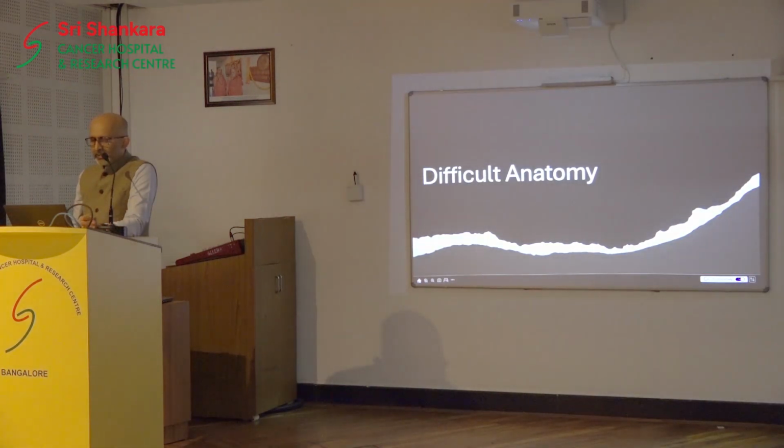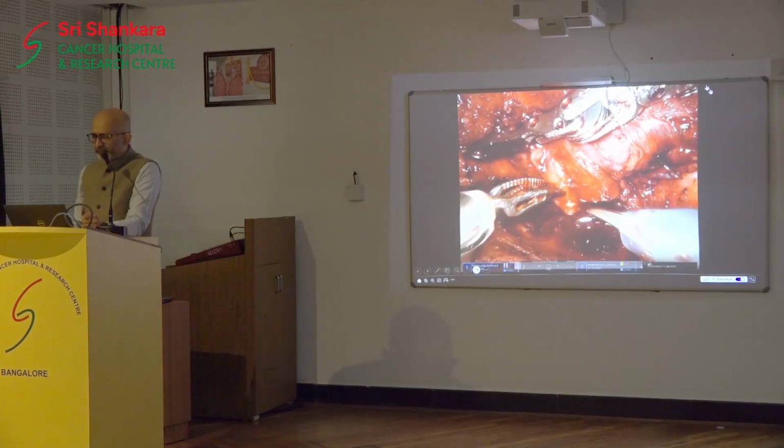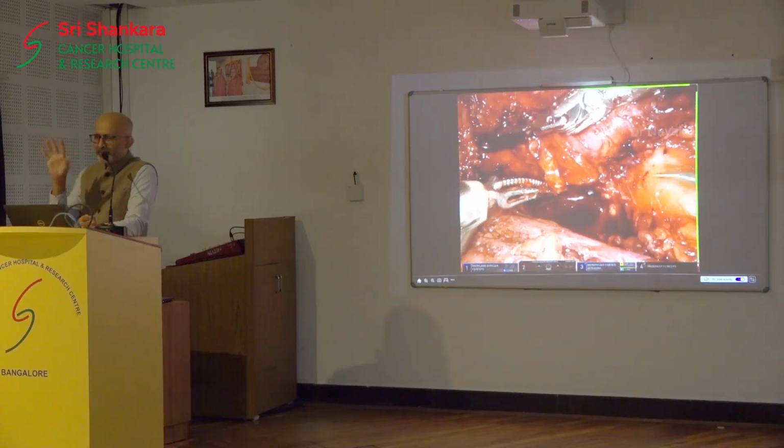So, can you handle difficult anatomies robotically? Yes, you can. In fact, this is one of the cases where I was looking desperately for the recurrent nerve. No recurrent nerve in sight.